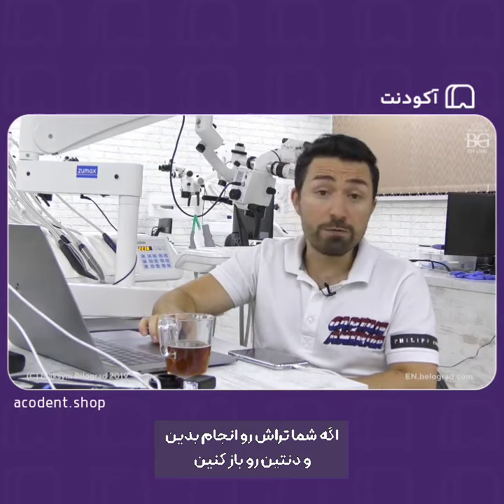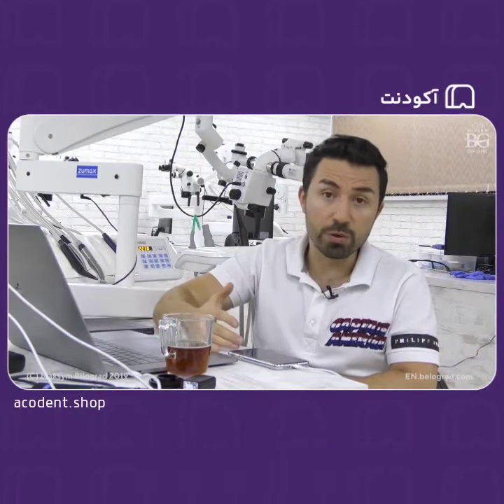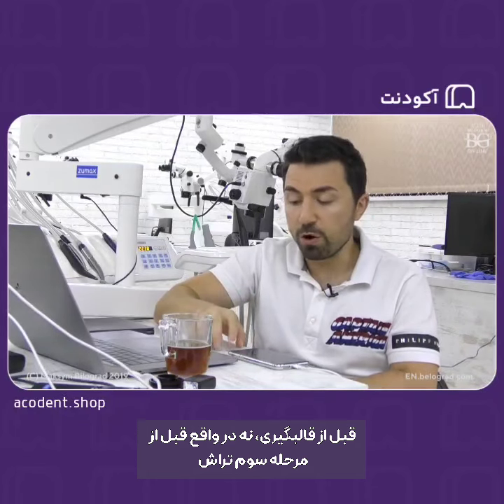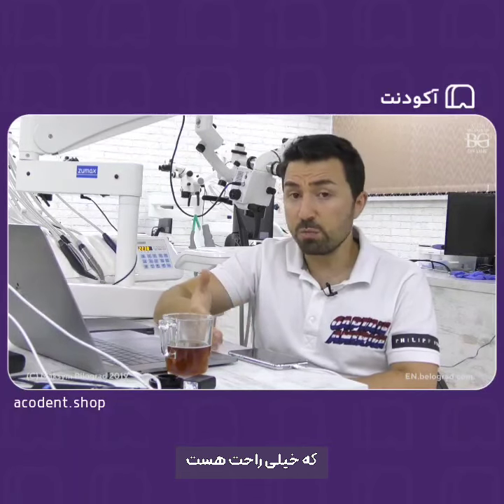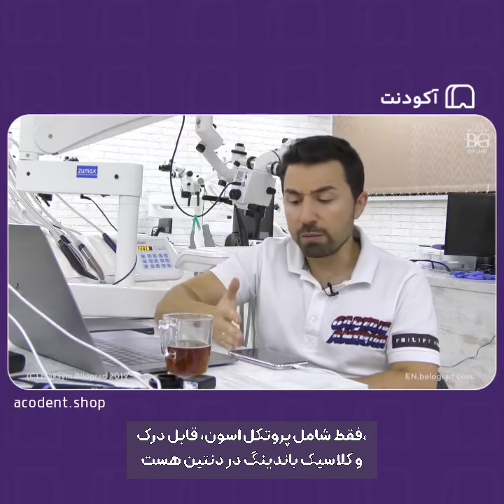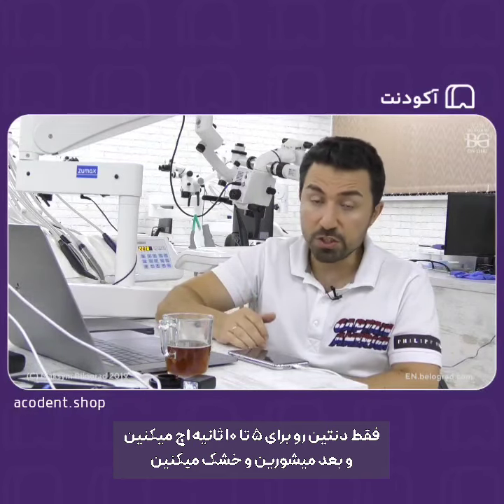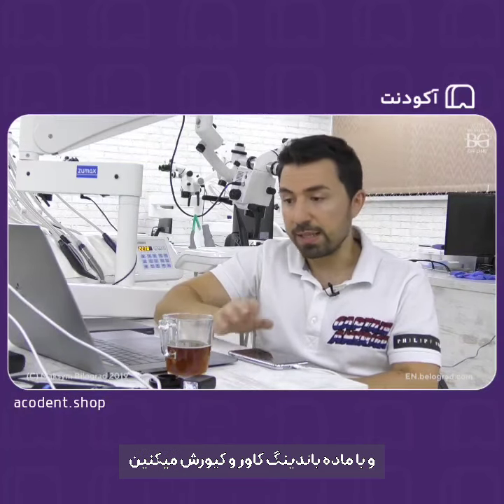Okay, so if you prep and you open dentin, you do immediate dentin sealing. This is one of the options. Actually, I'm following this philosophy. So if I prep and I expose dentin before taking impression, before step 3, yes, before step 3, I do IDS. The IDS is pretty simple. It's just a simple and understandable classic bonding protocol in dentin. If you use a total etch system, you just etch dentin for 5-10 seconds, rinse, dry, then you cover it with bonding agent. Then you light cure and that's it.